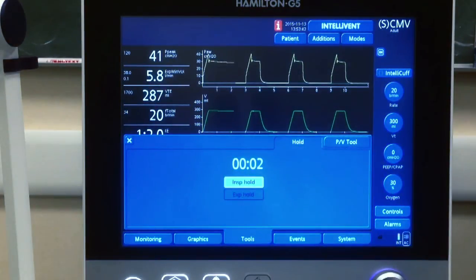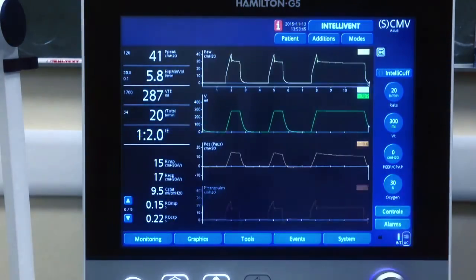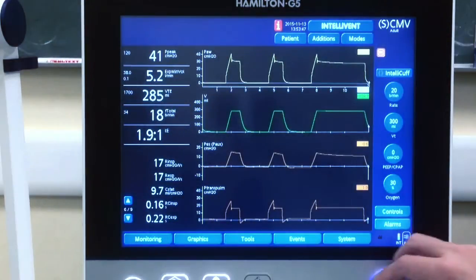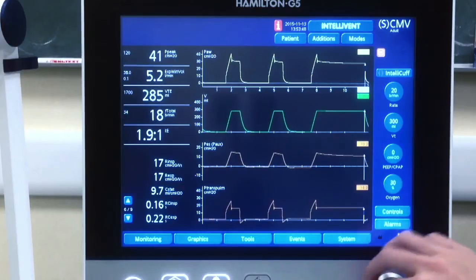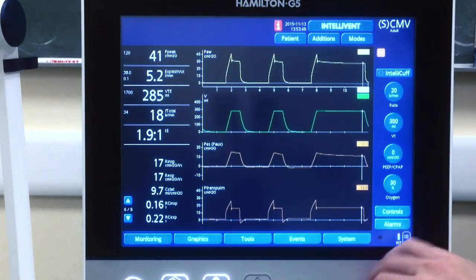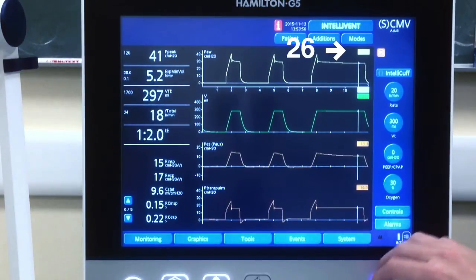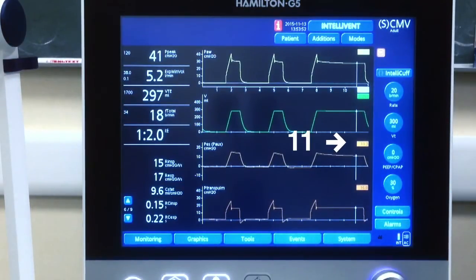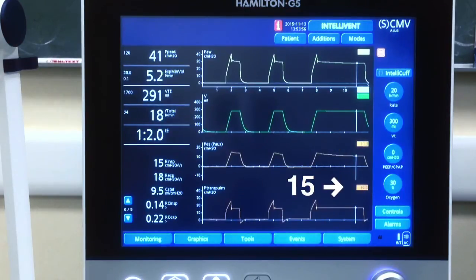First we need to perform an inspiratory hold and measure these numbers. Plateau of the airway pressure curve: 26. Plateau of the esophageal pressure: 11. Plateau of the transpulmonary pressure: 15, which is the difference between the two.